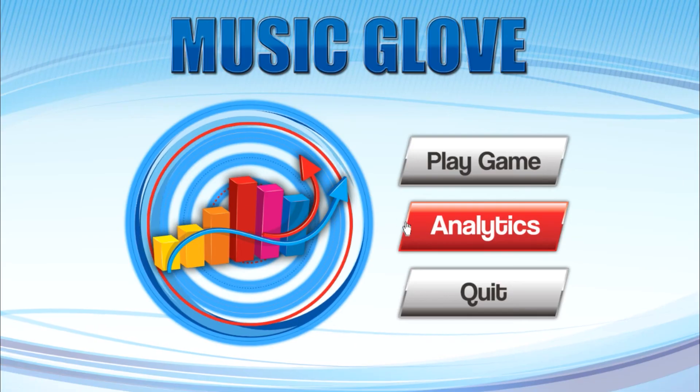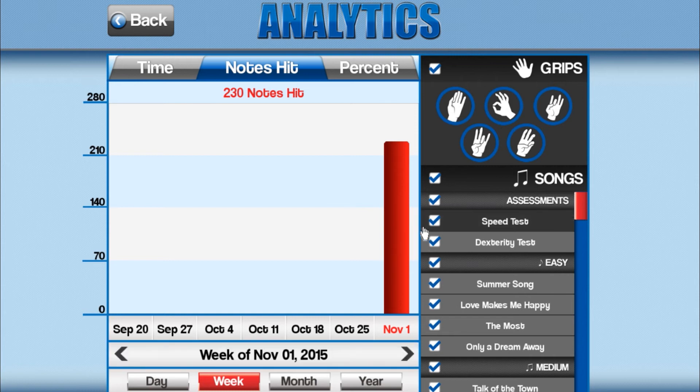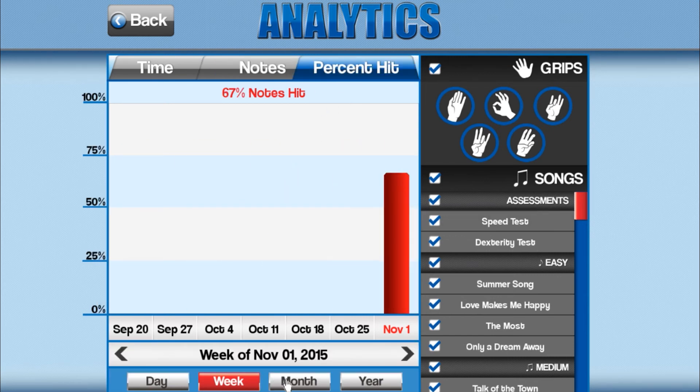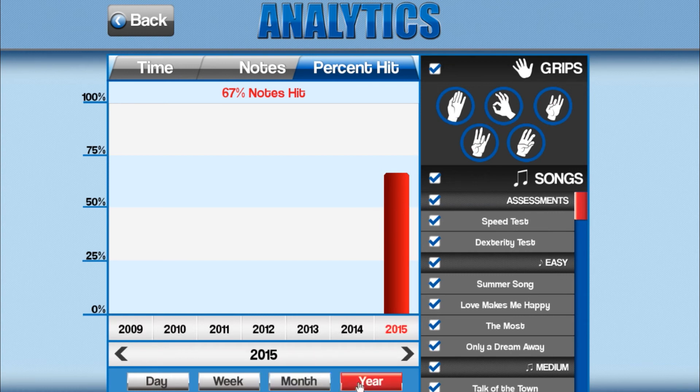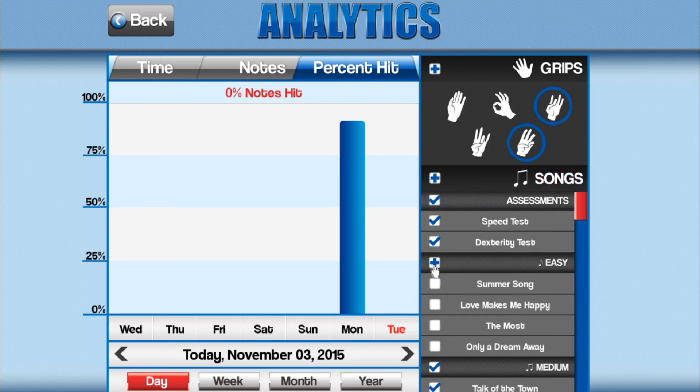Select End Session to bring up a summary screen that shows the cumulative performance for the current session. When you finish your session, select Analytics in the main menu screen. The Analytics screen lets you track your progress over time. Select the tabs on top to change the metric displayed on the graph. You can view the amount of time you have spent playing songs, the total number of notes hit correctly, and the percentage of notes hit correctly out of the total number of notes presented. You can also view trends grouped over time. On the right-hand side you will see the Options panel, where you can see specific trends for a specific grip or song.